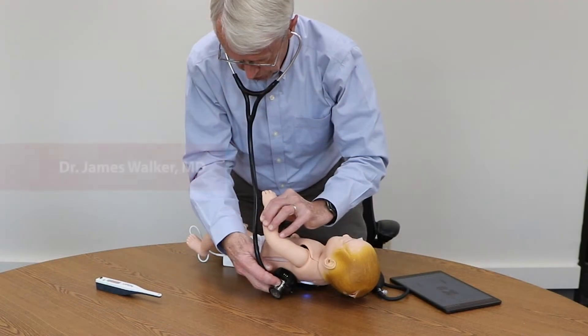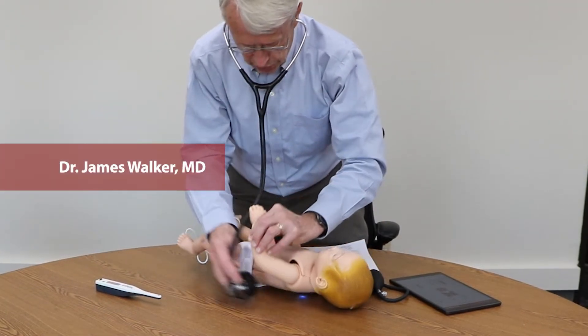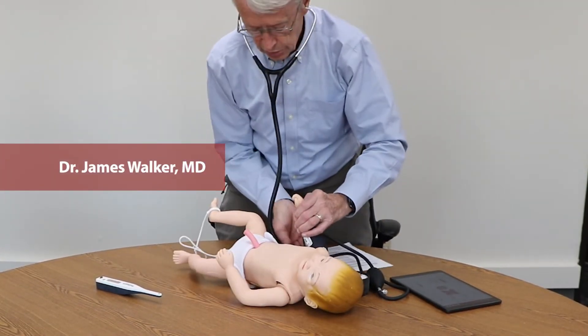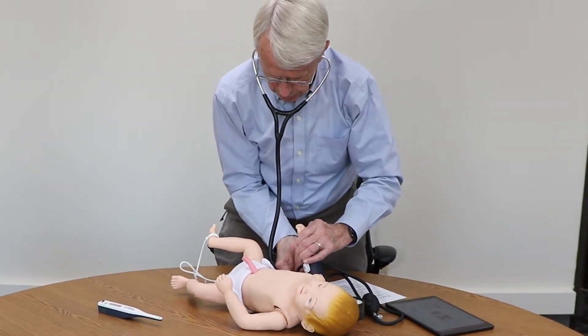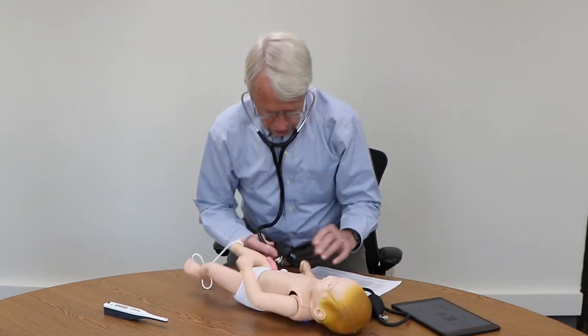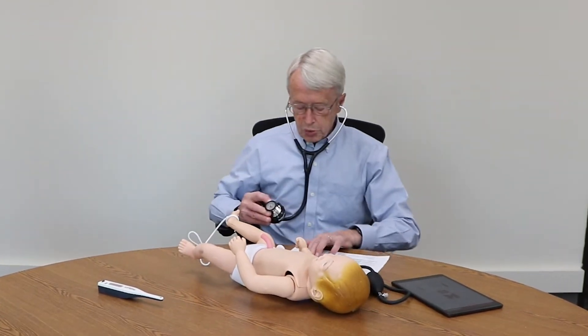The baby has some RALs, which are the sounds that we tend to hear with pneumonia, especially on inspiration. The respiratory rate is within a normal range at this point.